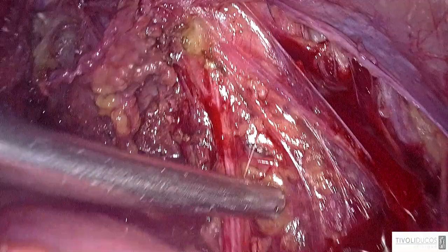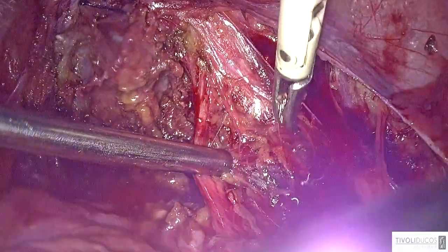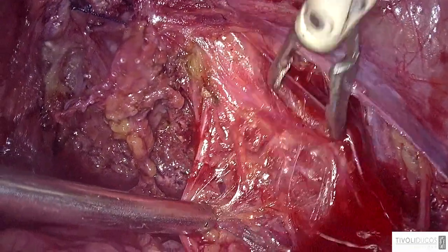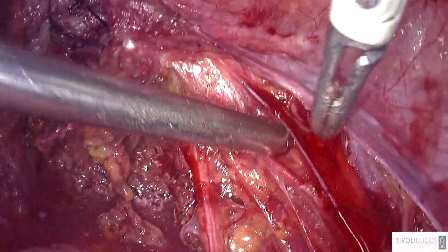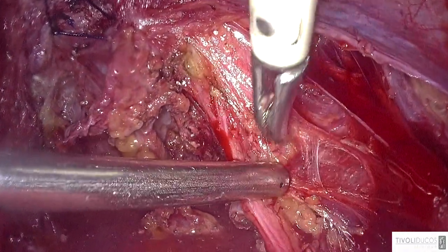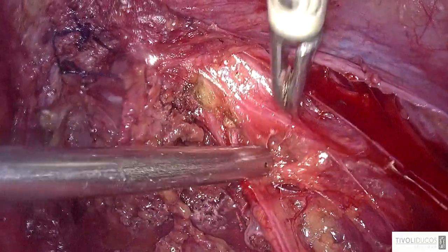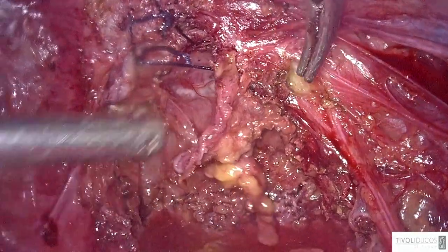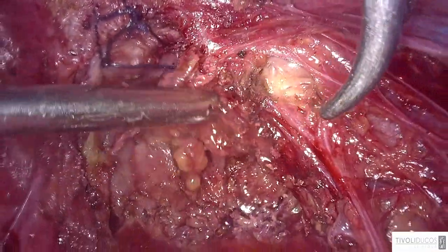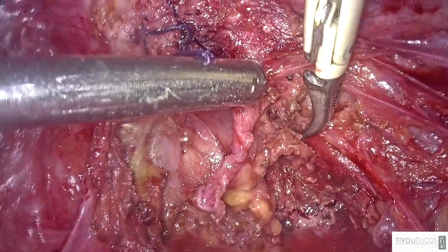So here you see you have several nerves, and I tested two weeks ago a very interesting system of nerve monitoring, neuromonitoring, and I intend to have it routinely for my surgeries on the parametrium. So I think that next year I can demonstrate how it is used, and you can stimulate the nerves to see if the bladder contracts or relaxes. It works very, very well, and the name is Inomed.